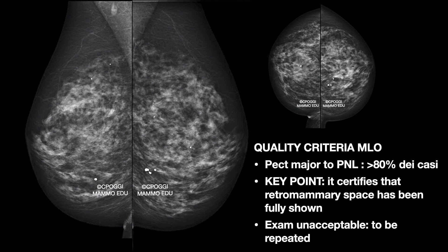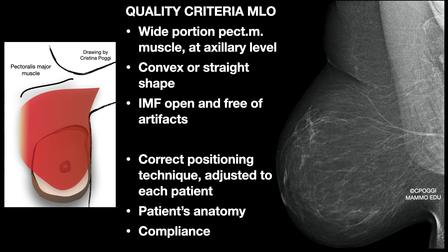In this example, there is not enough muscle in length, and so no retro-mammary space — even in CCs — and it is unacceptable. This is the muscle shape to have in every MLO projection. The shape is convex and very wide at axillary level, with the latissimus dorsi behind, showing a triangle more radio-opaque than the pectoralis. Wide and well-stretched in the central part and in the inferior part too, which presents itself with a rounded tail. This is the anatomical correspondence in the drawing.